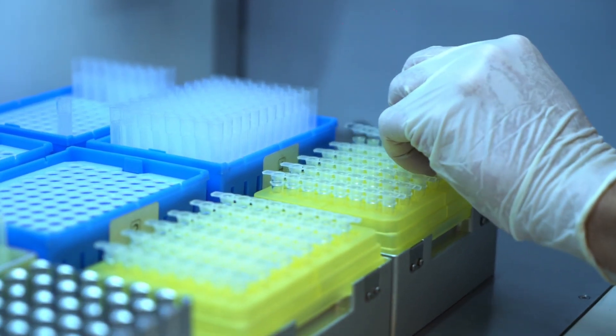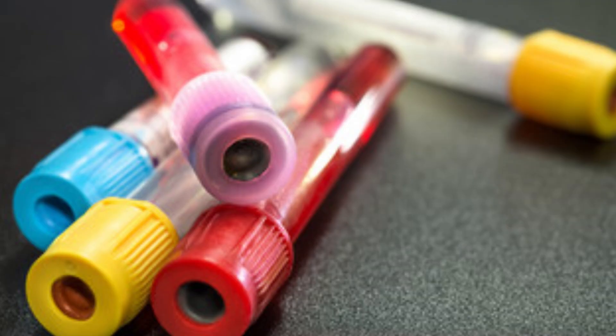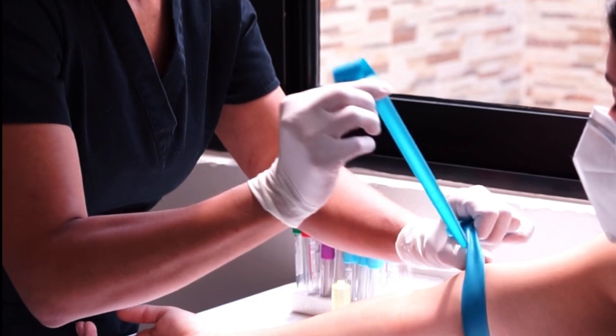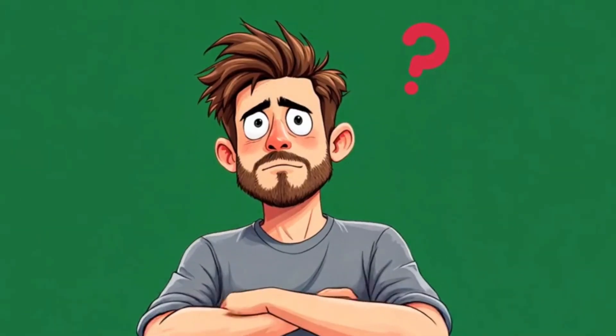So now you know — every tube colour has a specific additive and each additive has a specific purpose. Red for serum, blue for clotting tests, purple for haematology, green for electrolytes, yellow for cultures, and grey for glucose. The next time you see a phlebotomist pick up one of these colourful tubes, you'll actually know what's going on, and maybe impress your friends with your new lab knowledge.